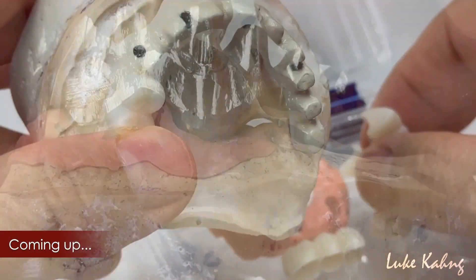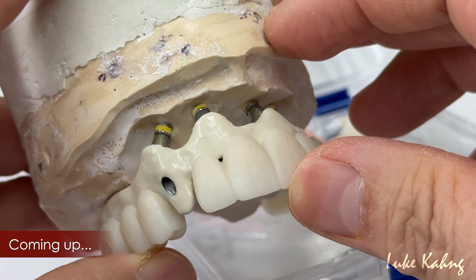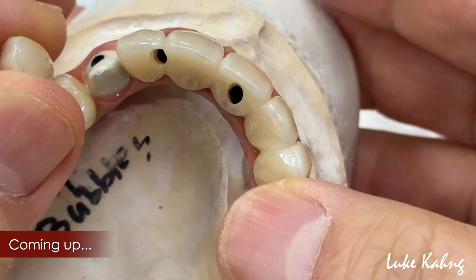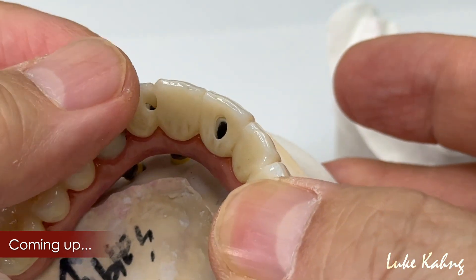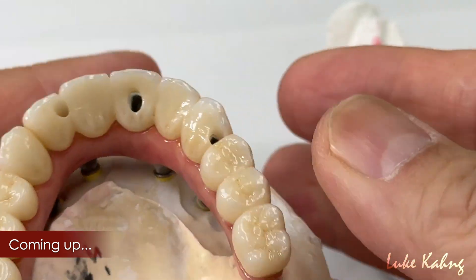Before we cemented these cases between the implant side, it was perfectly matching. Dr. Oli is going to scroll down. And also, here is one implant which is really far out facially. And then Dr. Oli is going to be using this temporary cement.